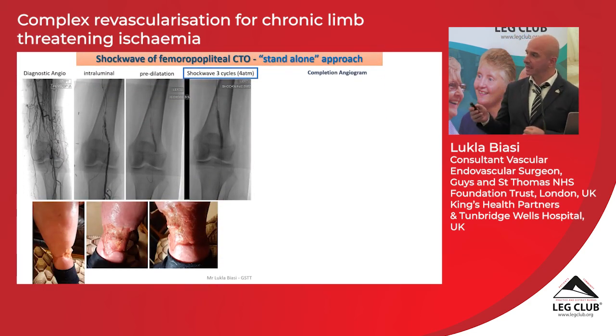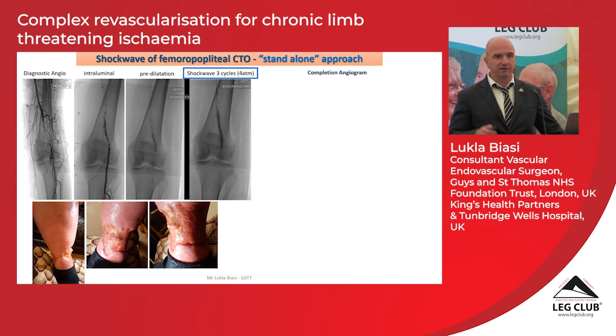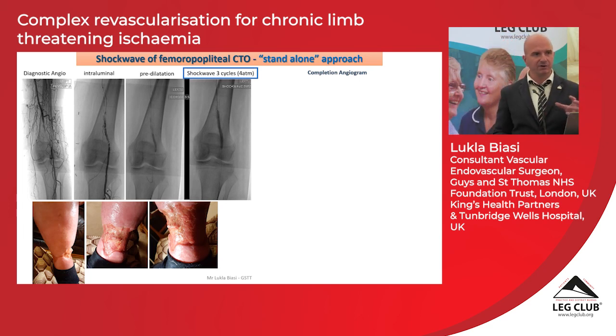Okay, that's actually my first case of intravascular lithotripsy. It was done just 3 weeks before the first lockdown. Elderly patient with a circumferential mixed etiology ulcer. Definitely venous stasis and dependent edema, venous insufficiency as well, but most importantly, peripheral arterial disease, a blocked distal SFA and proximal popliteal artery with a lot of collateral vessels that were good enough to keep the foot itself viable. The foot was actually pink with good capillary refill and even almost acceptable Doppler signals, but definitely not enough to heal a mixed etiology ulcer.